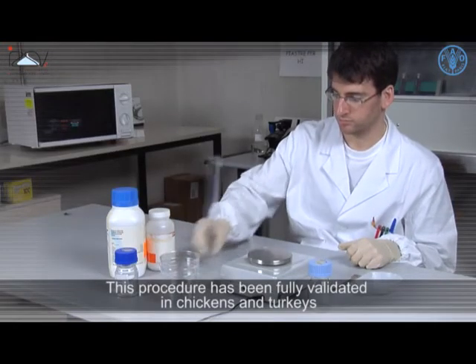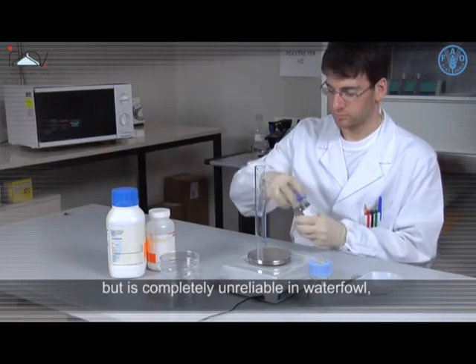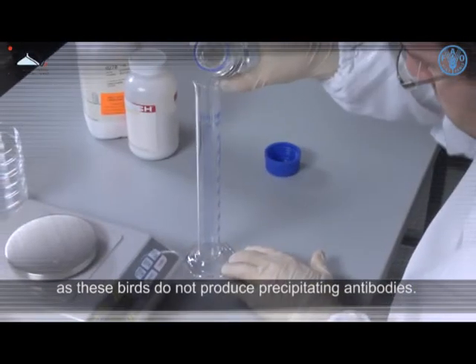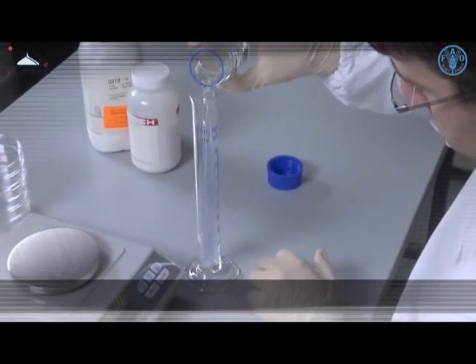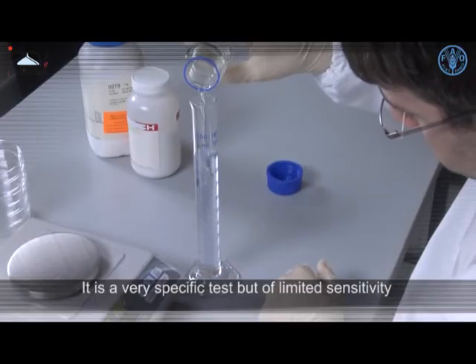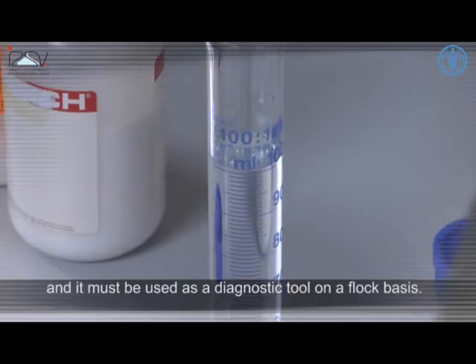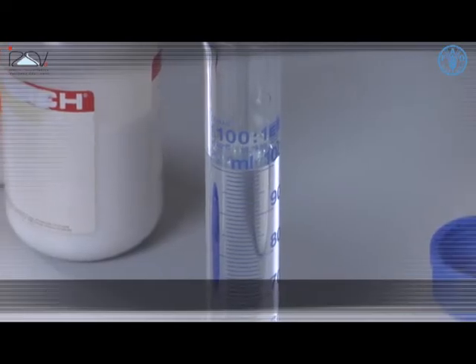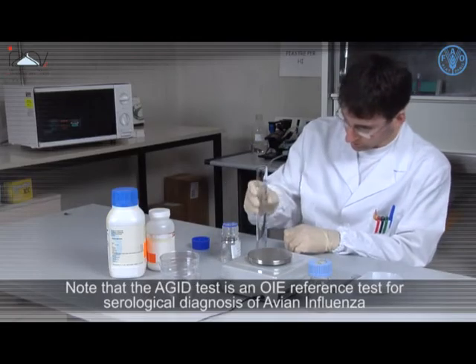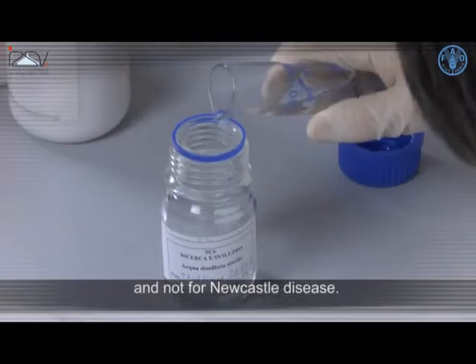This procedure has been fully validated in chickens and turkeys but is completely unreliable in waterfowl, as these birds do not produce precipitating antibodies. It is a very specific test but of limited sensitivity, and it must be used as a diagnostic tool on a flock basis. Note that the AGID test is an OIE reference test for serological diagnosis of avian influenza and not for Newcastle disease.